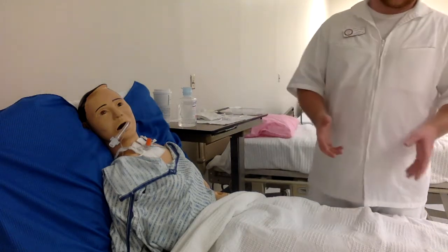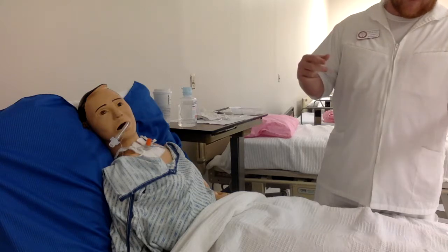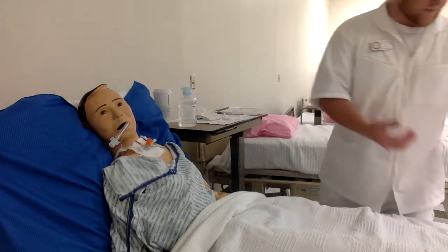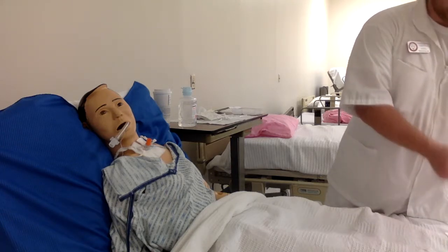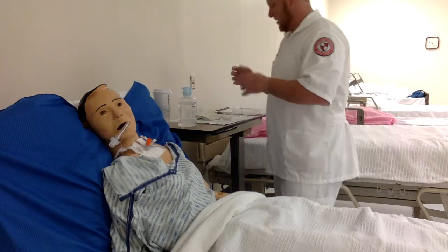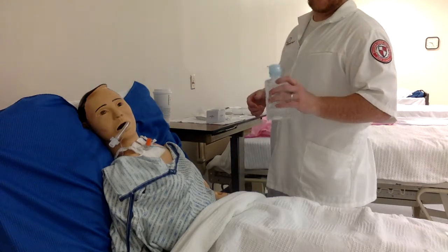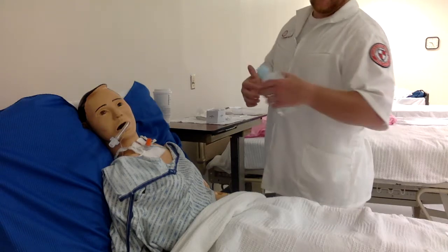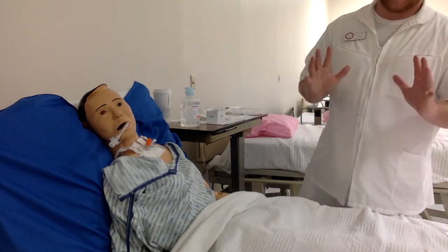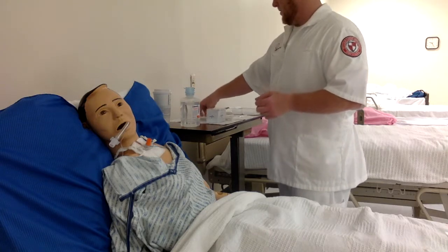From this point on I will be using sterile gloves. But first, while still in clean gloves, I'm going to pour the saline into the small container on the kit — making sure no bacteria gets inside. Once the saline is poured, I wash my hands again and put on my sterile gloves. From this point on, my hands are sterile and I can touch everything on the sterile field.